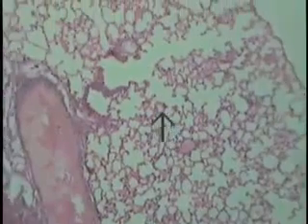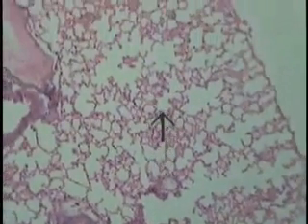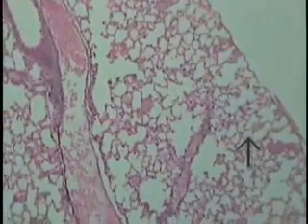So this is what is being talked about: these long tubular structures, or the lumen looks like a long tube, but its wall is made up of successive alveoli, the alveolar ducts. These eventually terminate in a rounded, more saccular type of structure known as an alveolar sac.